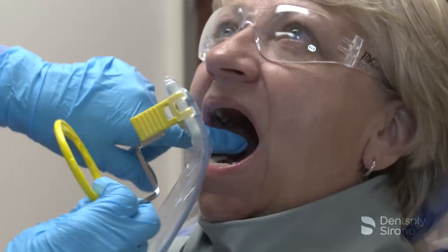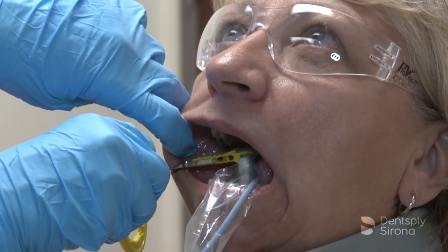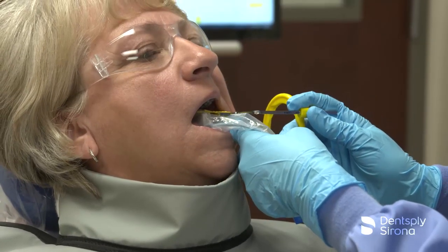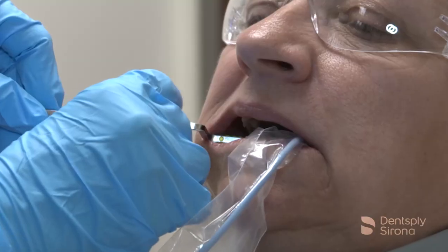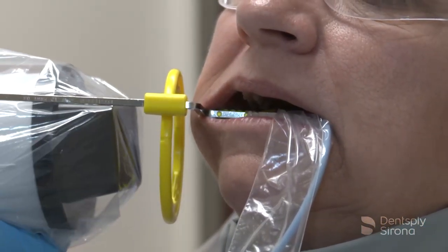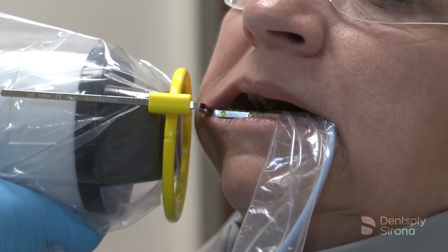When assessing the mandibular molar region, position the sensor in the patient's mouth, centering it behind the second molar. Allow the sensor to find its way comfortably by resting the bite block on the second molar's occlusal surface. Ensure that the mesial edge of the bite block is between the first and second premolar contact point. Once the bite block is in place, slide the aiming ring down the arm close to the patient's face, align the tube head, and the X-ray image is ready to be captured.